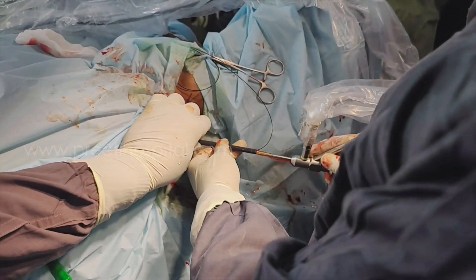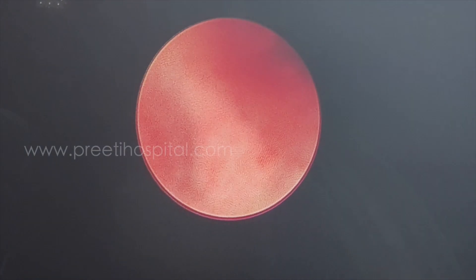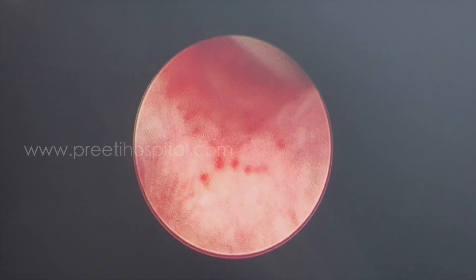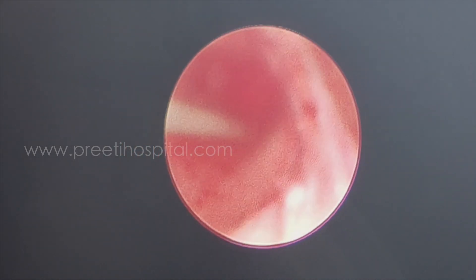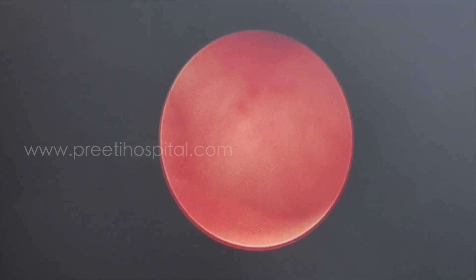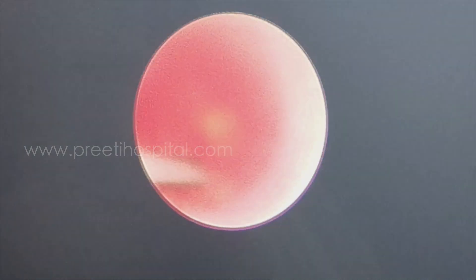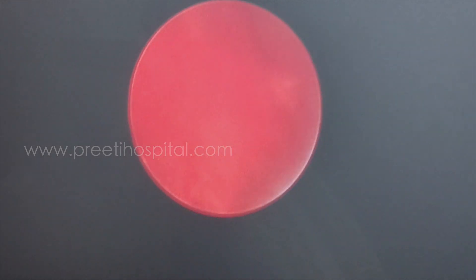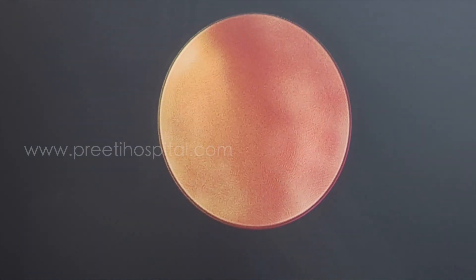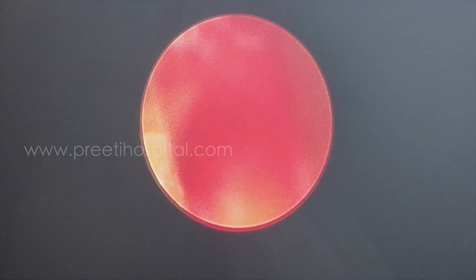Now we will switch over to scope. A stone is up but posterior — see, nice. Which calyx is it in? One calyx is posterior — that means you are slightly anterior. Can you see the infundibulum nicely? All infundibula. Go nicely there, spend some time, and do the stone. If you use nicely laser or pneumatic lithotriptor, everything can be seen.